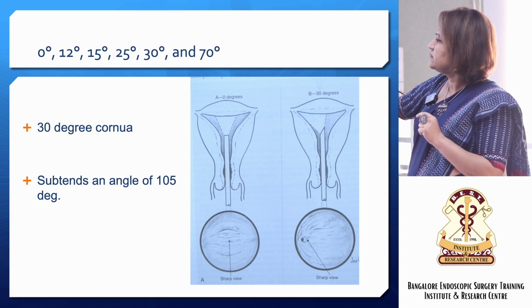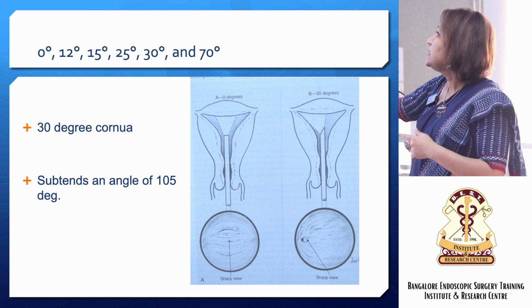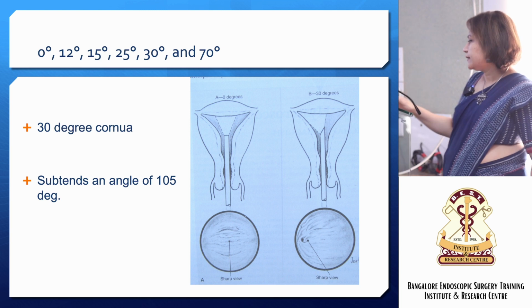Now because, sorry, does the light come on here? Anyway, I'll go like that. So most of the time we use a 30 degree scope.